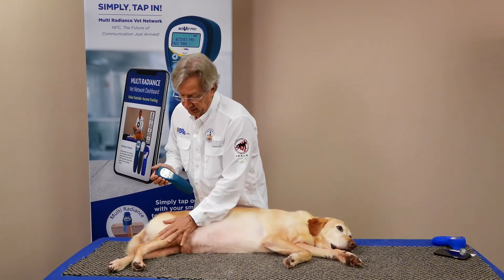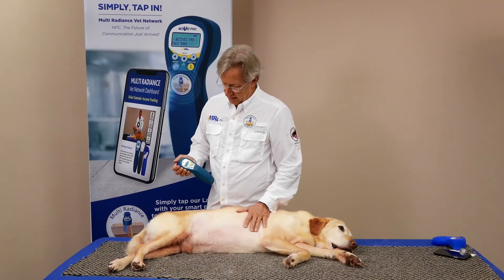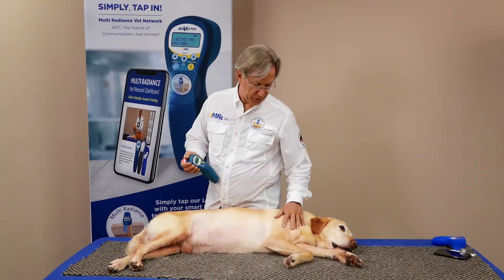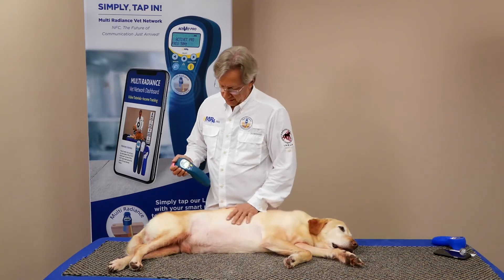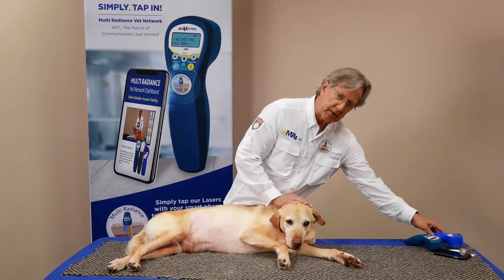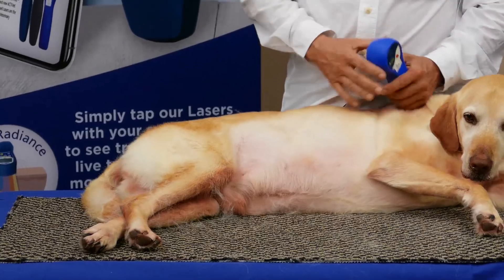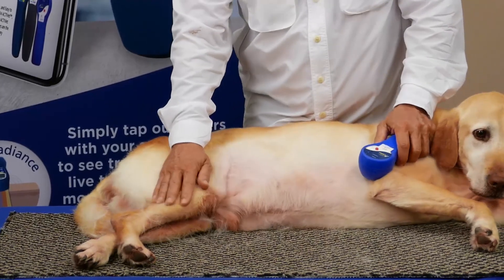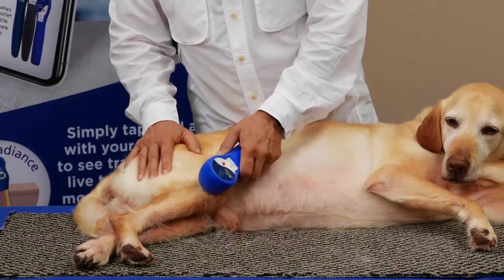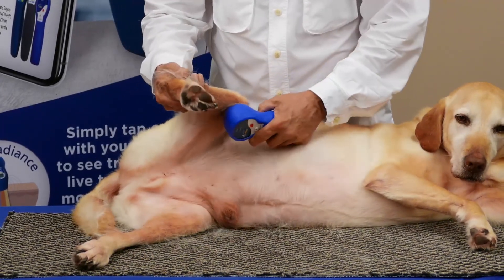Reduce first the arthritic pain, then the inflammation, then allow tissue repair to make the animal much more comfortable. You'll be so amazed by the activity levels of your dog and how much happier they are when you take away that pain. This is a great way with the My Pet laser to continue treatments at home. By sending your client home with our laser, they can use it at home just as easily with no stress, no worries, no anxiety — totally safe. A series of treatments gives you a much better outcome and makes that dog much happier for years to come.